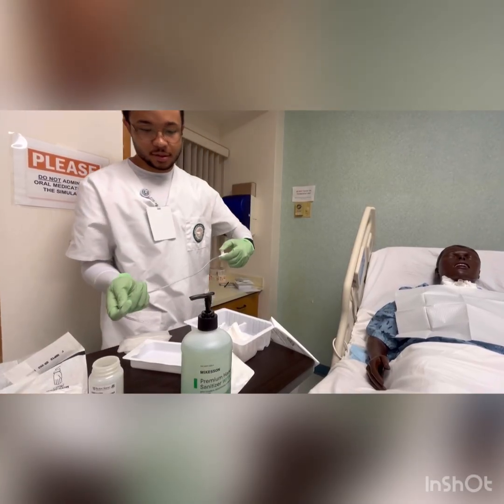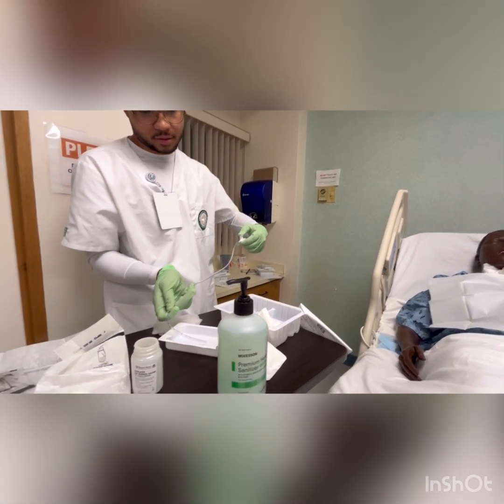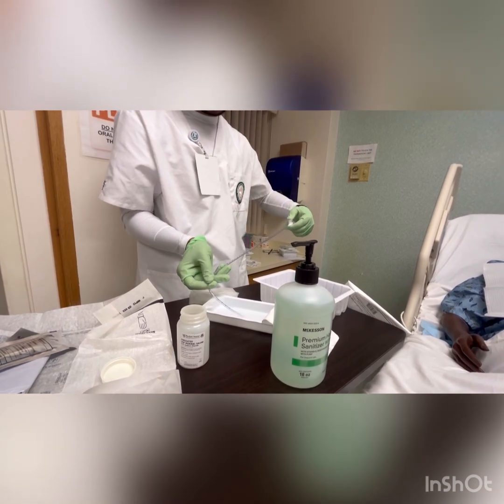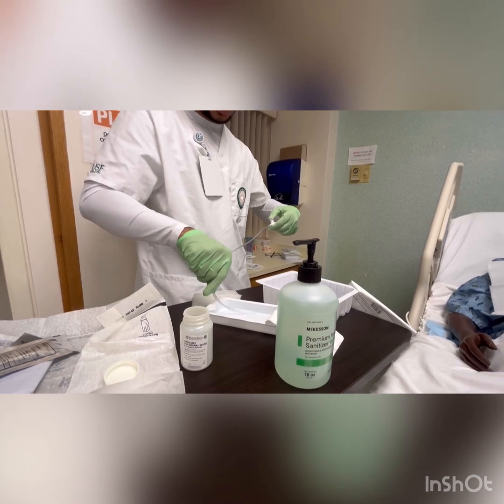Put the tip of the suction catheter into the sterile container of the normal saline solution and suction a small amount of normal saline solution through the catheter, and then apply suction by placing a finger over the suction control port of the suction catheter.